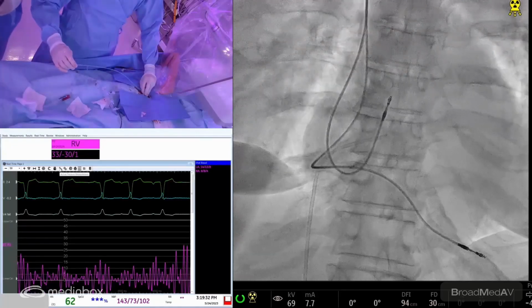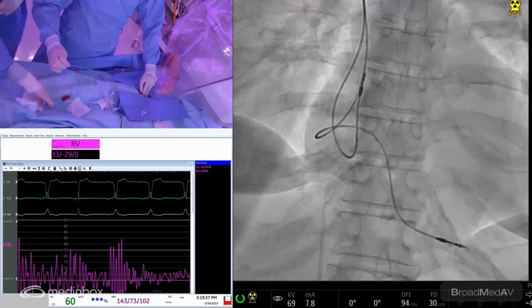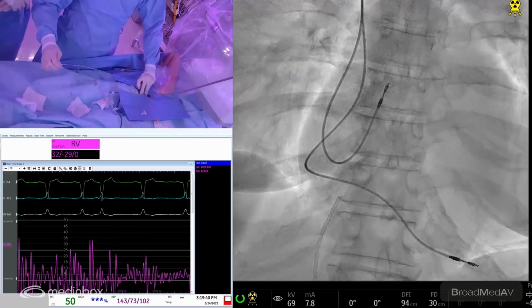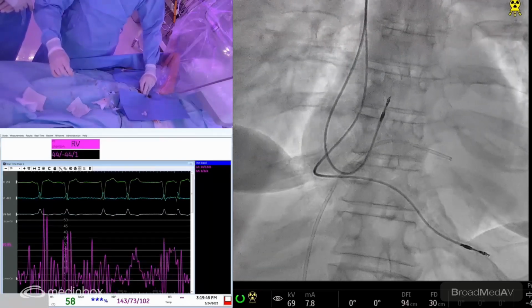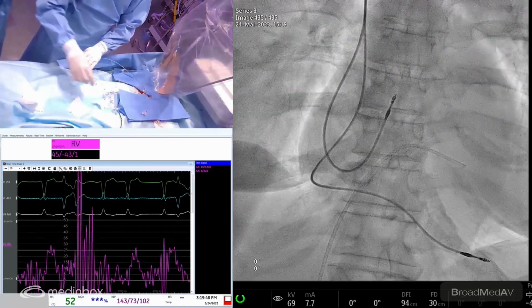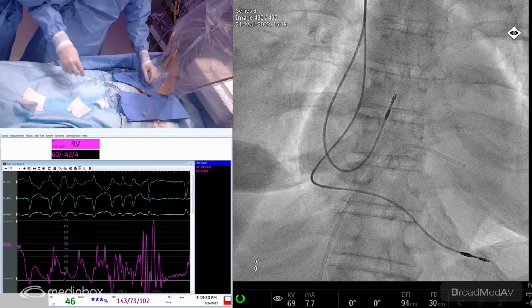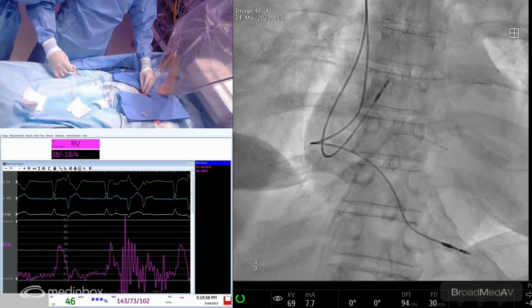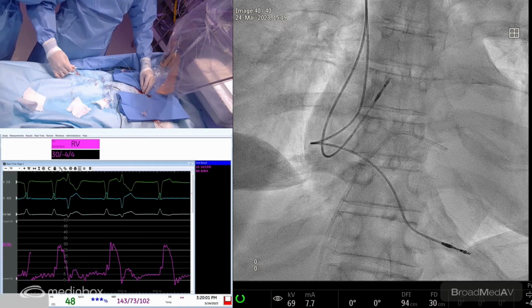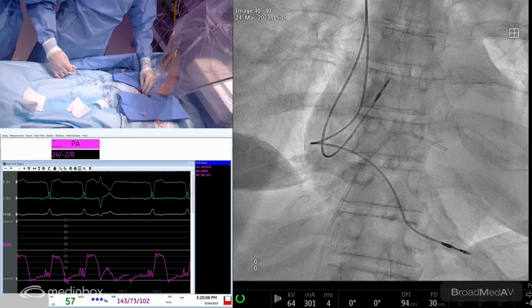That's where you have to be careful. So here we have a pacemaker lead in the RV. So typically you need to follow the trajectory of the lead to go in the right ventricle. So that we are in the RV. Should be it. So if the systolic RV pressure is normal, it typically means there's no pulmonary hypertension. Just wait for no extra systoles to be there. Yeah. That's better. So this is now the RV pressure.